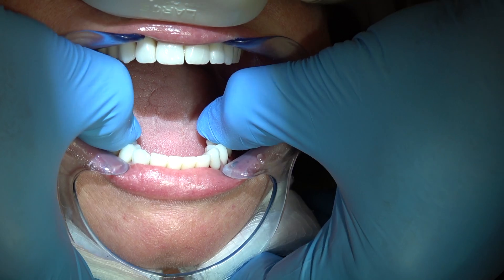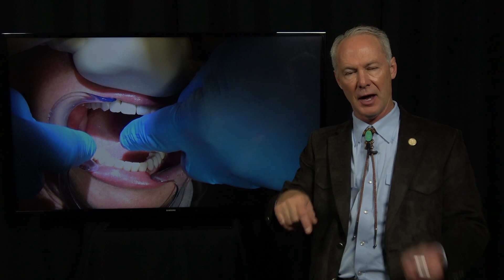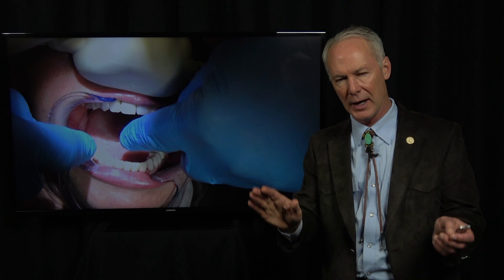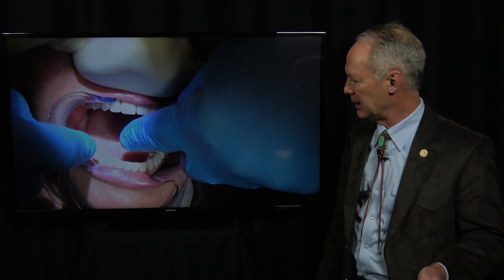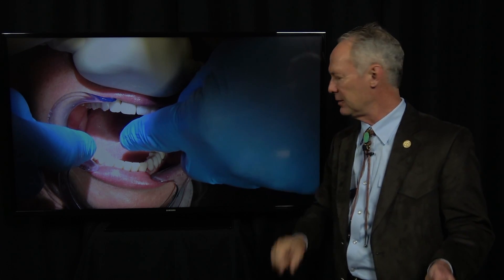This is waxed floss. As my assistant puts her finger on the crown and the adjacent tooth, I'm going to pop the floss through the interproximal contact. But do not remove the excess cement until it reaches initial set. You never want to wipe excess cement off with a cotton ball — you want to have to break it off, to break off the initially set cement so you don't develop a void in the micro gap between the crown and the tooth.